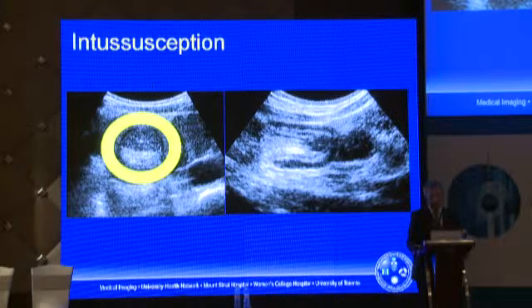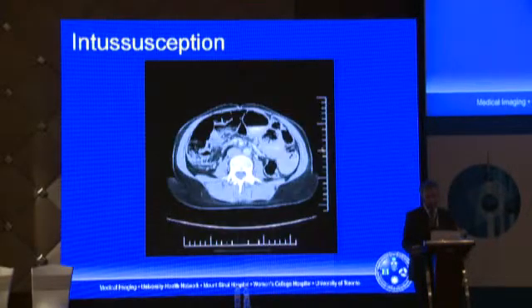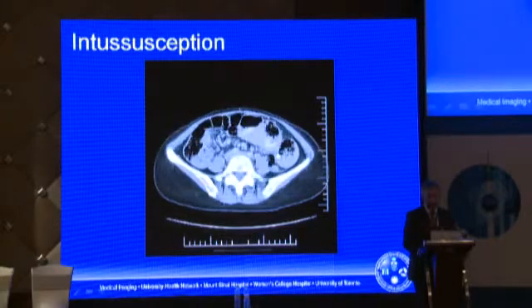You can see the mesentery being pulled in here, and then in sagittal we see the muscularis propria and the intussusception. Where things differ in adults, of course, is that there's invariably a lead point, so there's invariably a mass. So we don't routinely try to reduce these with enema in adults. And when you're imaging them, you should look very carefully for a lead point.